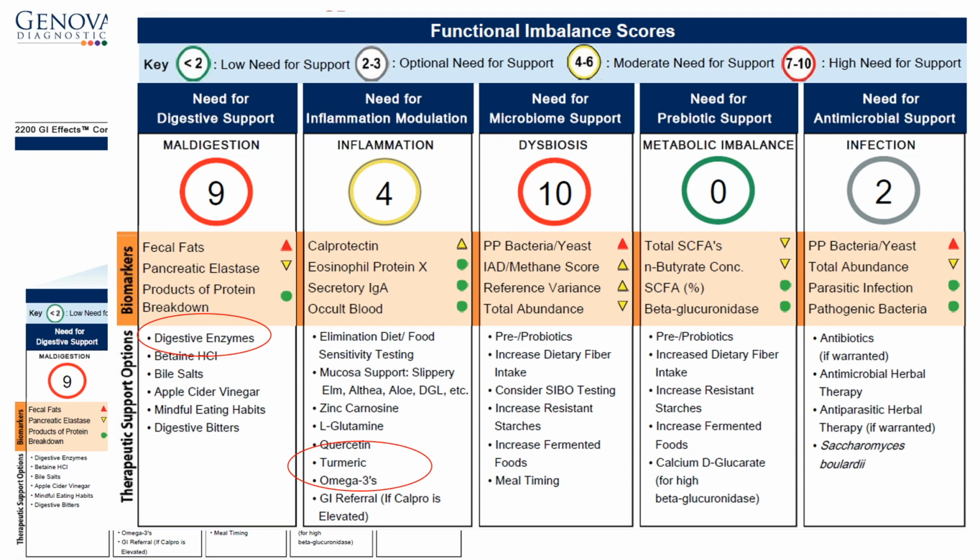One more thing to consider with the inflammation, the patient did have a normal screening colonoscopy 8 years ago, and these are performed every 10 years. So depending on the patient and their history, some clinicians may choose colonoscopy if they have concern and the patient has never had a screening colonoscopy at this age. She's 72.